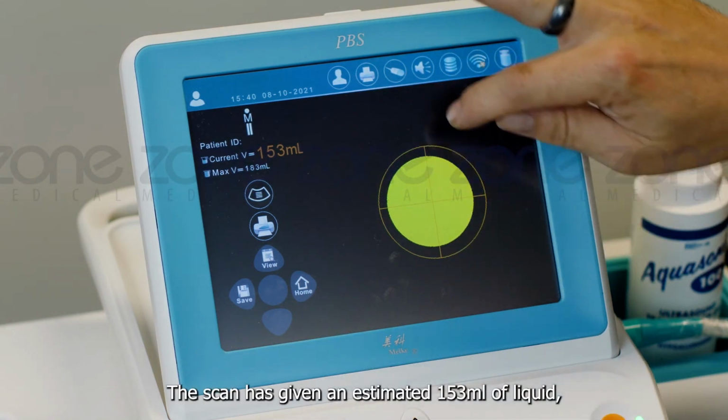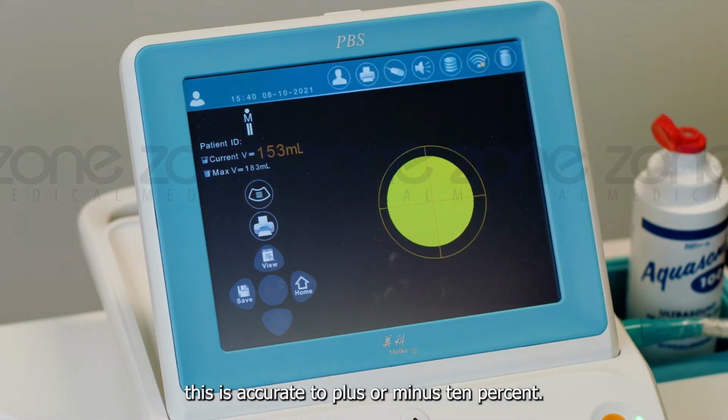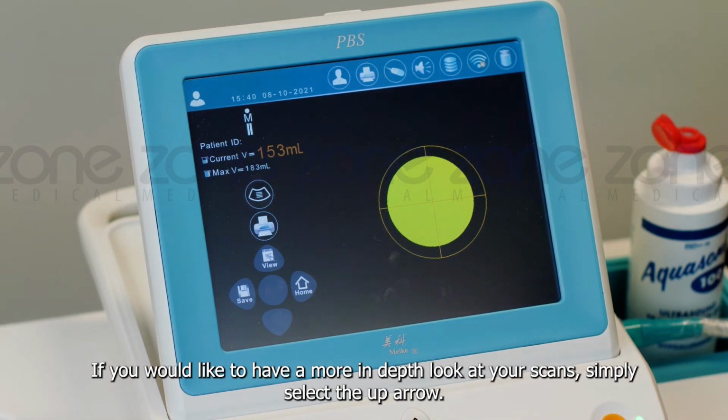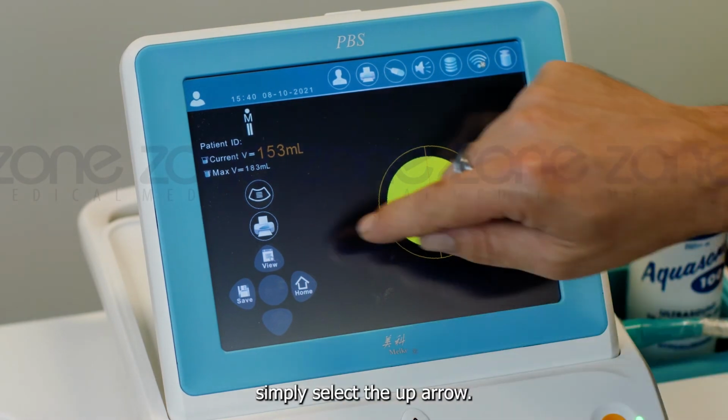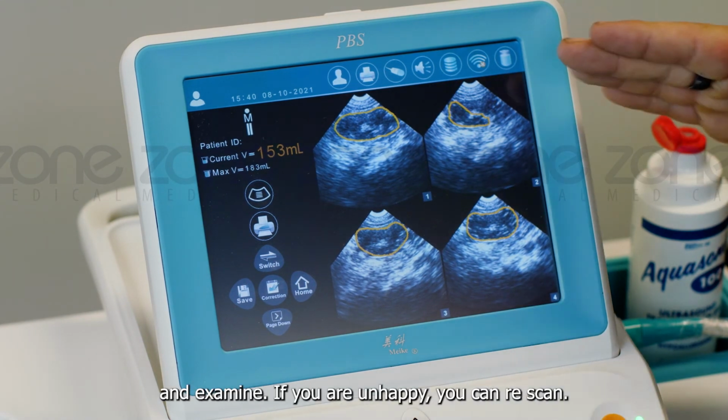The scan has given an estimated 153 milliliters of liquid. This is accurate to plus or minus 10%. If you would like to have a more in-depth look at your scans, simply select the up arrow. This now displays all 12 scans taken, in which you can review and examine.